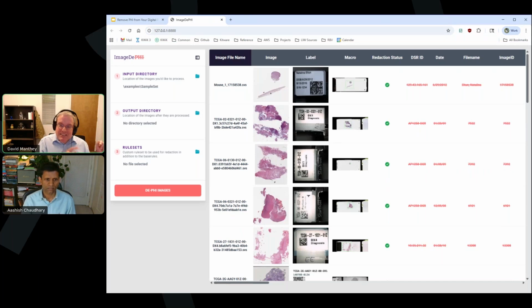This is a piece of metadata inside the file called file name. These are confusing things because you can also have an extra image inside the image called thumbnail, which is an image that may or may not be an actual thumbnail of the main image. It's just another image with that name. And so by default, we don't want to keep whatever file name it had internally. That could be something that's exposing information that we don't want. By default, we can get rid of it.